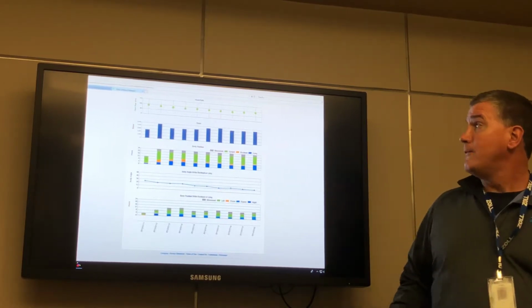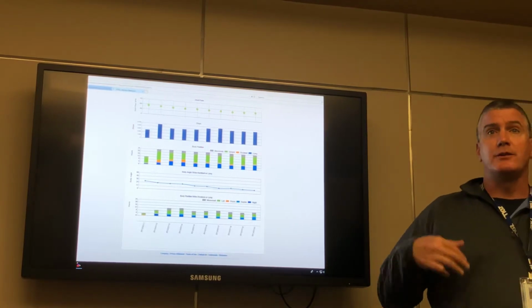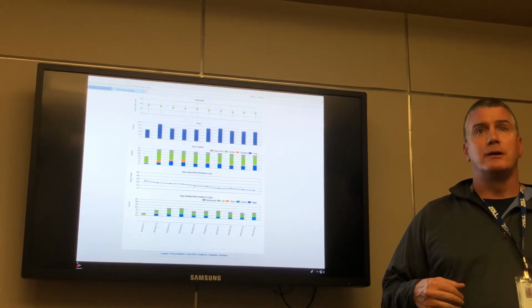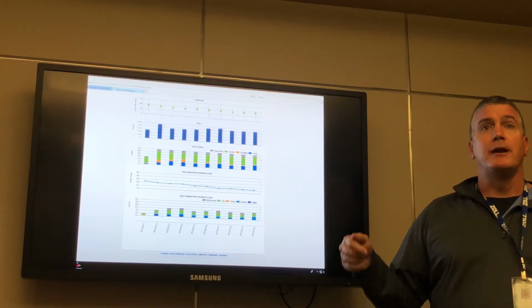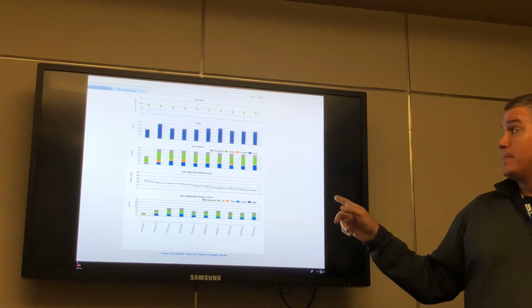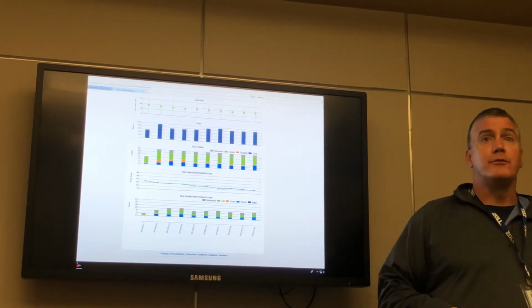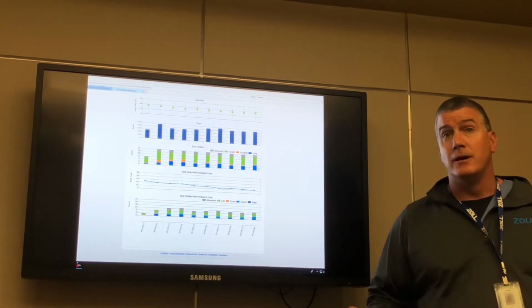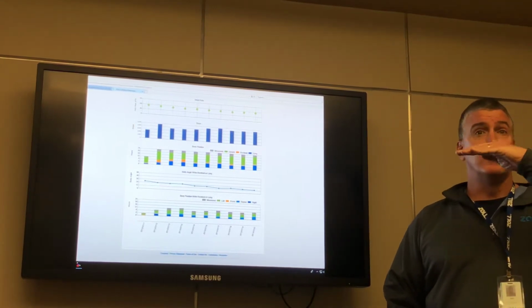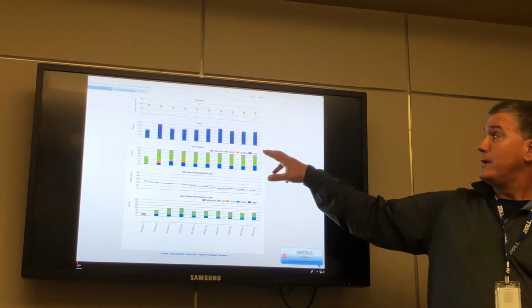So, you know, we've actually captured where we've been able to bring patients into the heart failure clinic early and get them tuned up so they never get readmitted. So this could help with readmissions for patients. It may be a patient that ran out of money and can't afford their meds and stopped taking their meds. And then you see their heart rate normal, and then all of a sudden they go up. So this is great information right here.